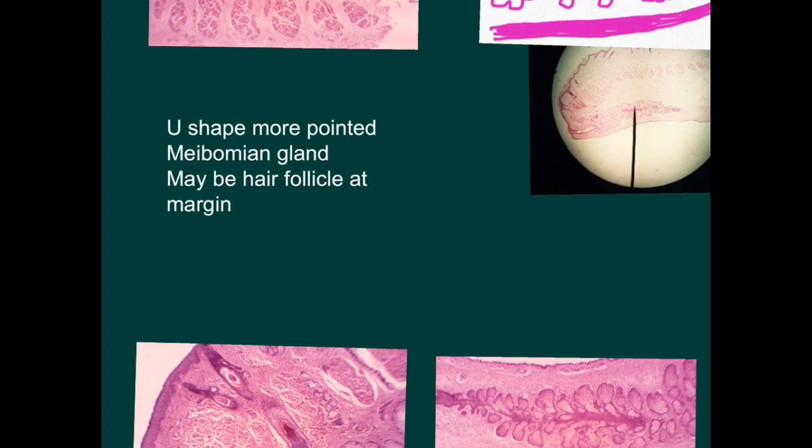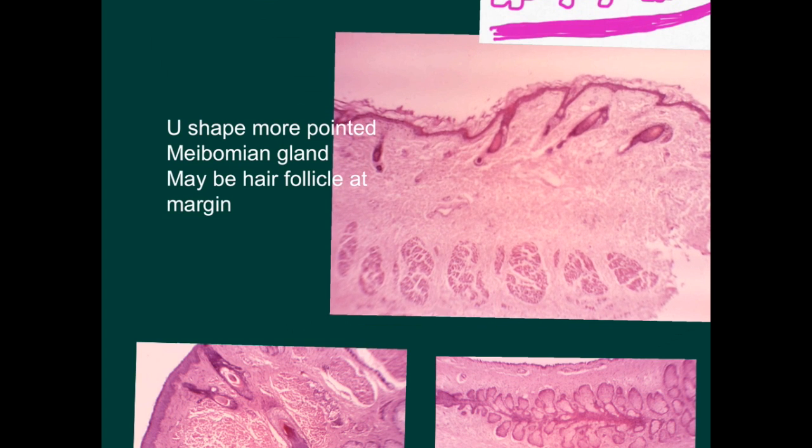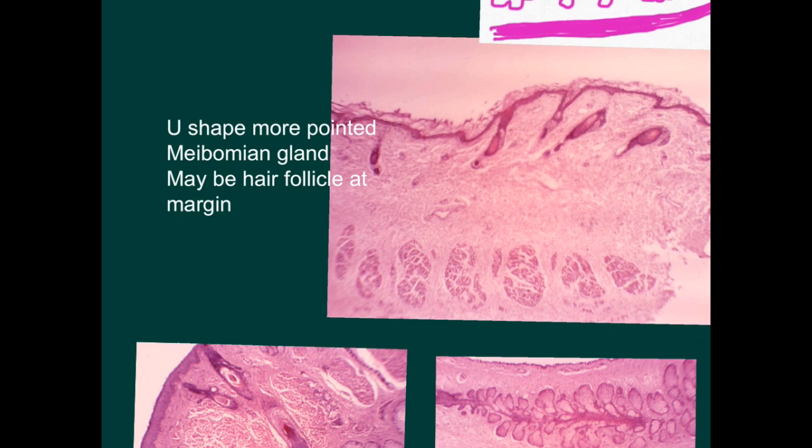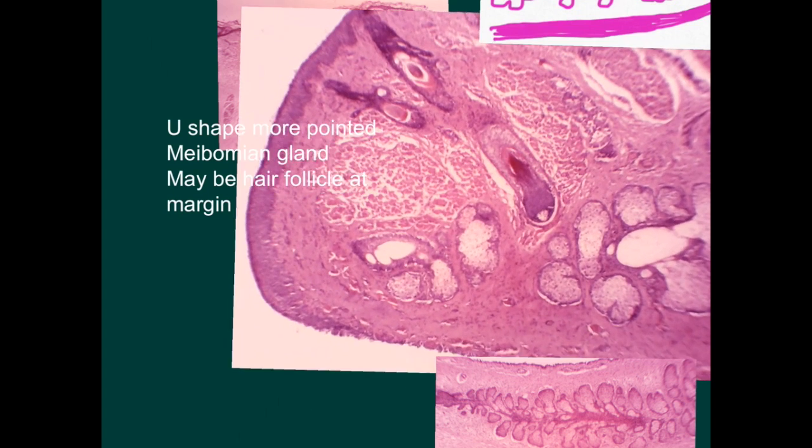Now, let's take this picture. This is the skin side, and here we have the hair follicles, and related to the skin side, we have the muscle. And this is a very nice picture also for the eyelid.